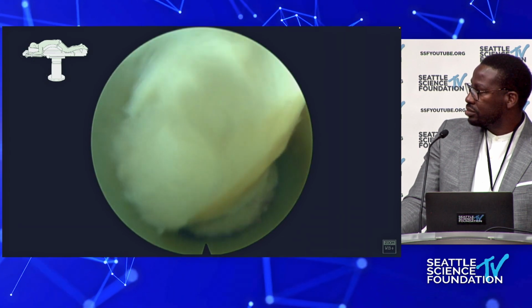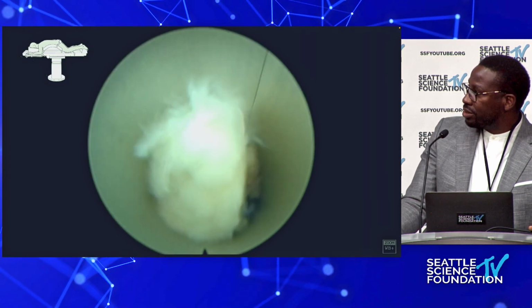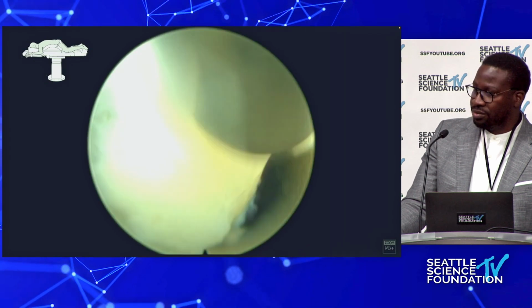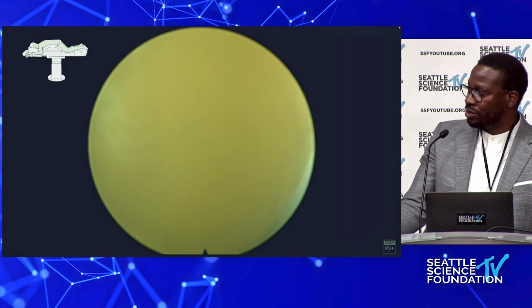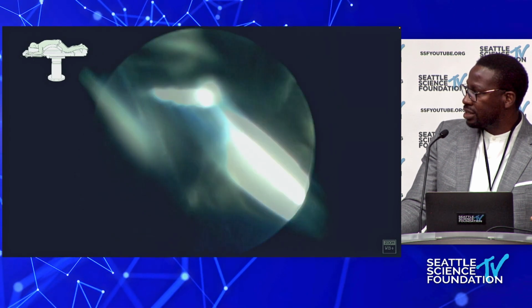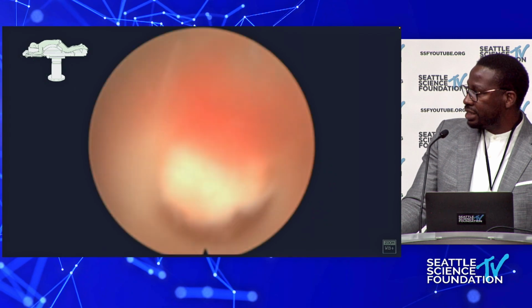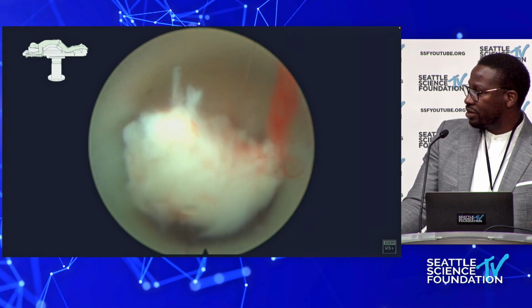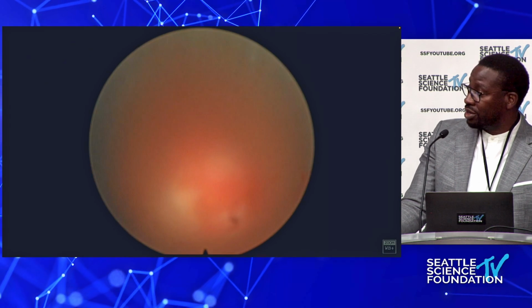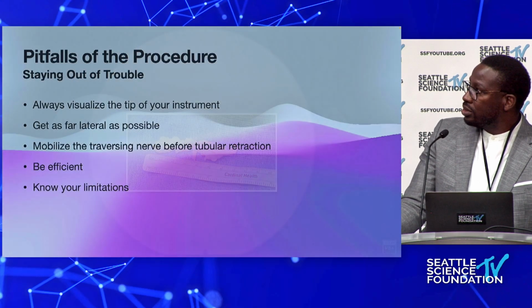And all I'm doing really is just twisting the scope. And so the reason why I think it was able to be delivered so easily is because we targeted the maximum part of that disc that was in the actual axilla. And then, of course, being able to land there and open right above that disc, and then also going back and finding leftover fragments. But the targeting was important, but also the disc was probably under a significant amount of pressure. And that's that patient there.